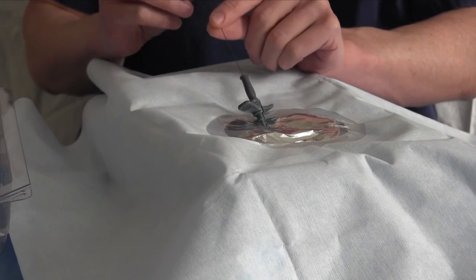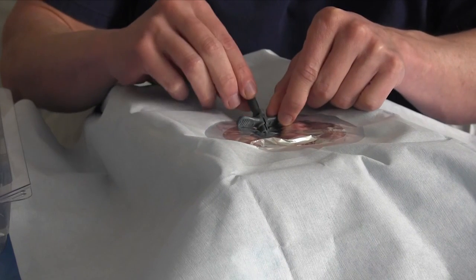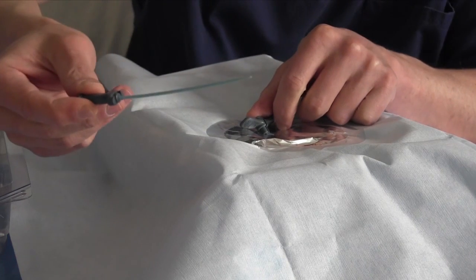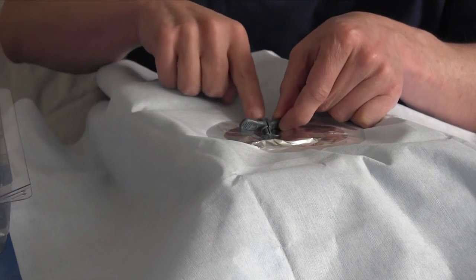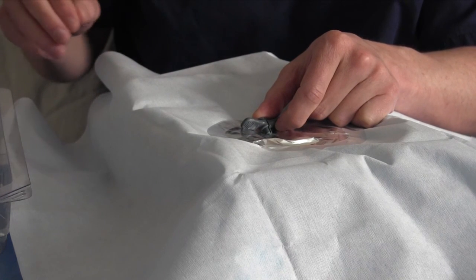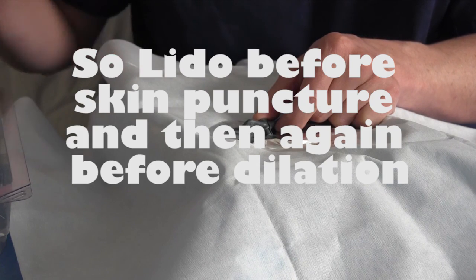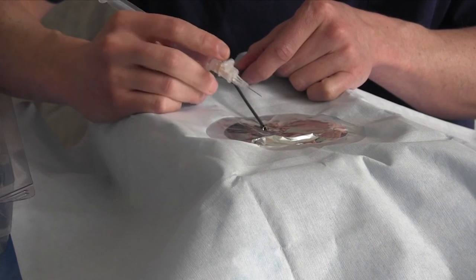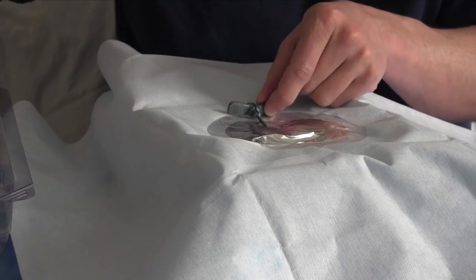And now, if you take the wire out, you're going to turn counterclockwise, half turn, quarter turn actually, and take out this dilator portion. So now the wire and the dilator portion of this sheath are out. And now what you have essentially is a big sheath in the vessel. This part is painful, this dilation step. So in general, I would have anesthetized the site before sticking with the needle. And before doing this dilation, actually right at the skin over the wire, give a nice 2 ccs of lidocaine into all that skin directly at the point you want to dilate, and that's going to make it more comfortable.